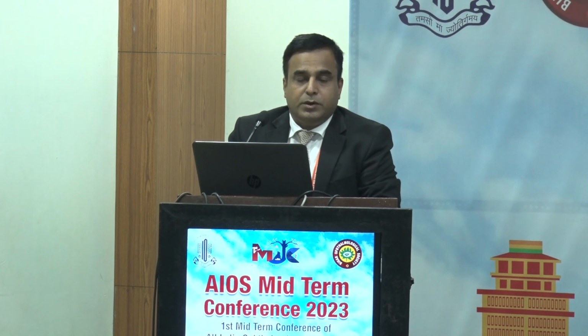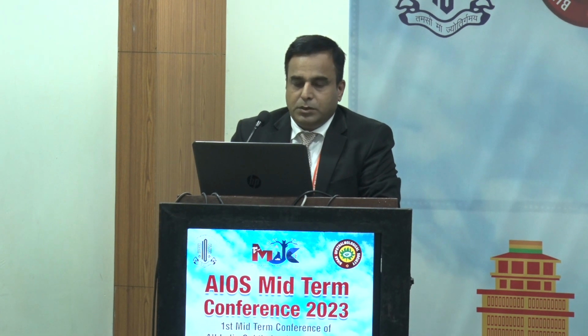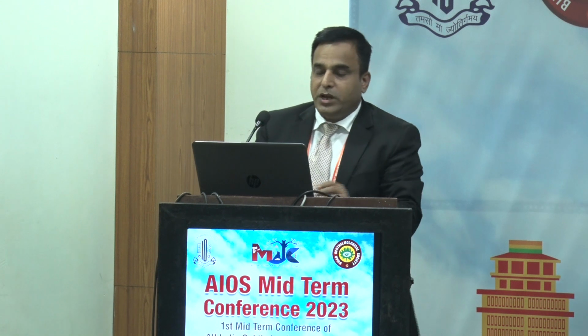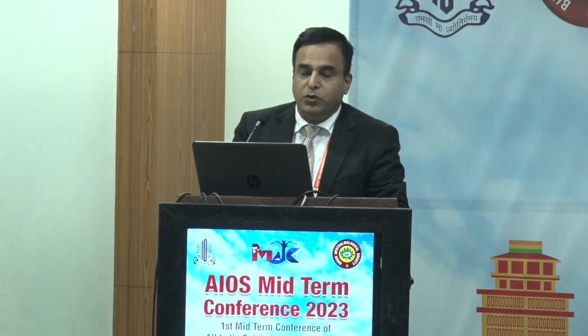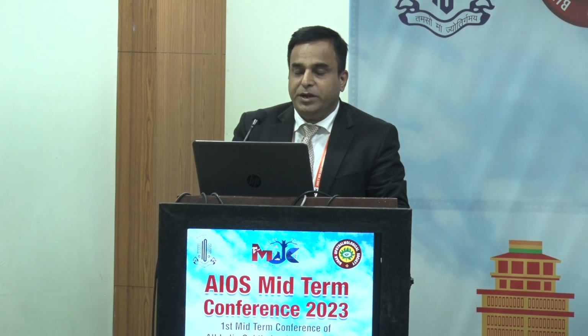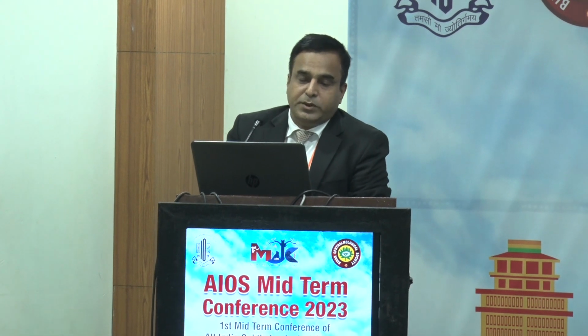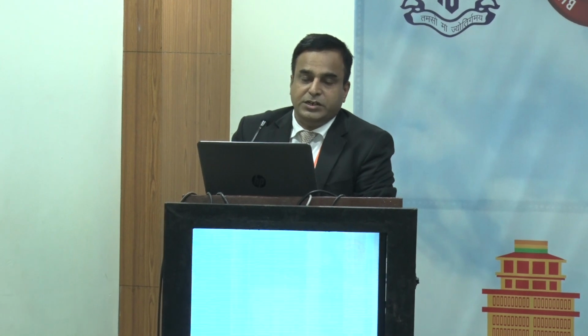So this is one of the most original retinal imaging photographs, documented by Purkinje on his own eyes using the entoptic phenomenon with blue lights. So this is probably the first documented retinal imaging picture. So retinal imaging, what is it? It is documentation of a 2D image of the three-dimensional retinal tissue.